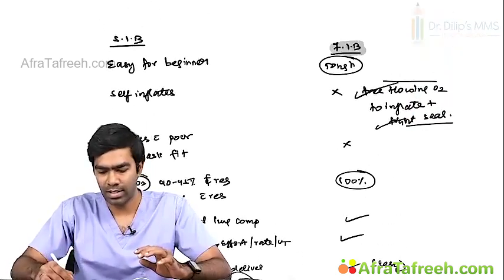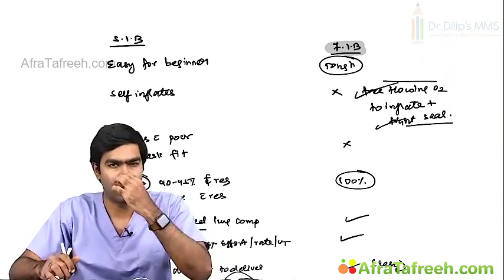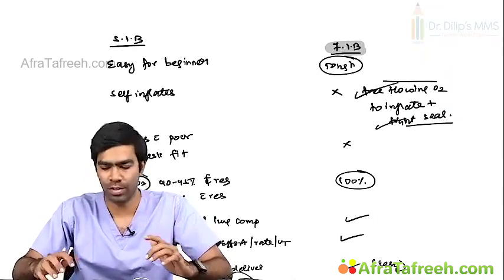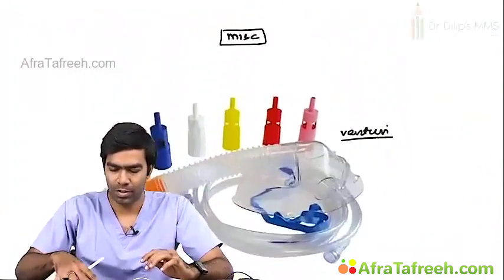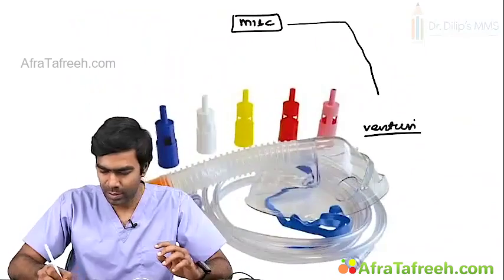Remember, a flow inflating bag needs an expert. Definitely, we don't give it to a beginner, or to a staff nurse or a paramedic usually. You need an expert for this. Okay, we move on to the miscellaneous devices.